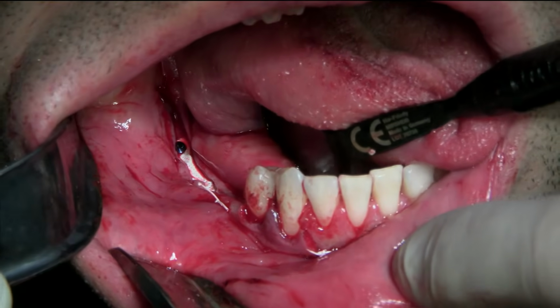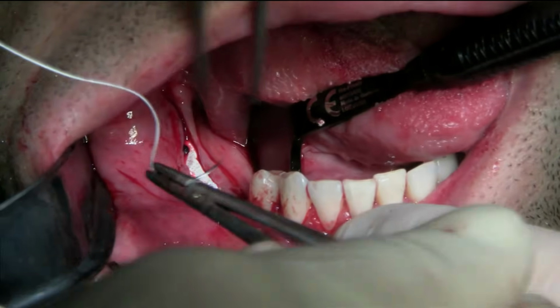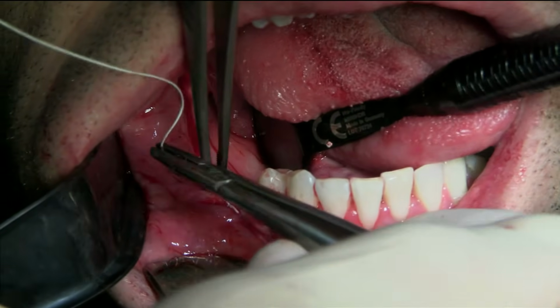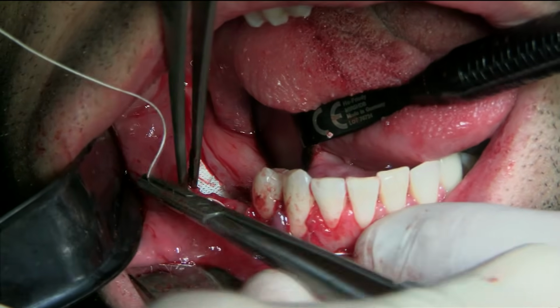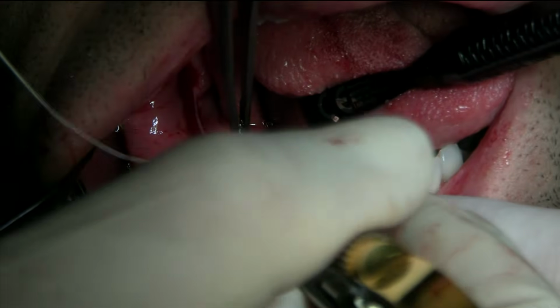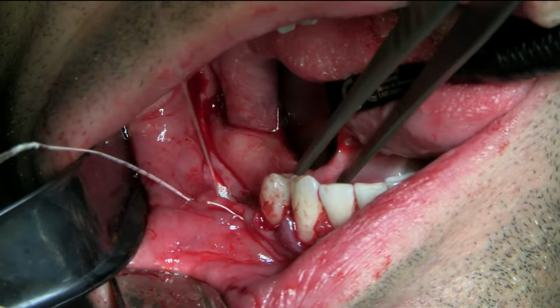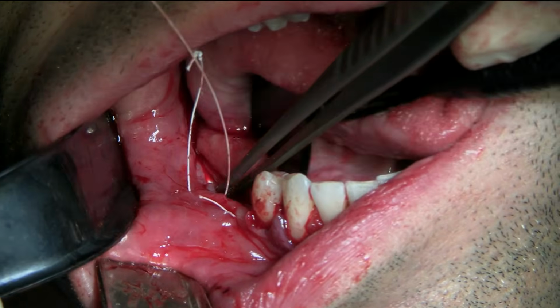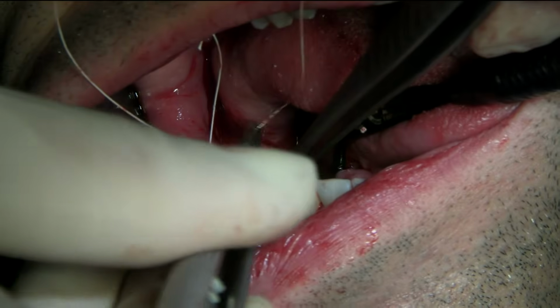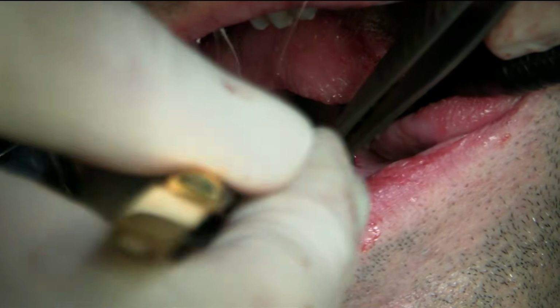Okay. And the second mattress. Got to grab the lingual. And again, I want to get some thickness. Okay, that's good.